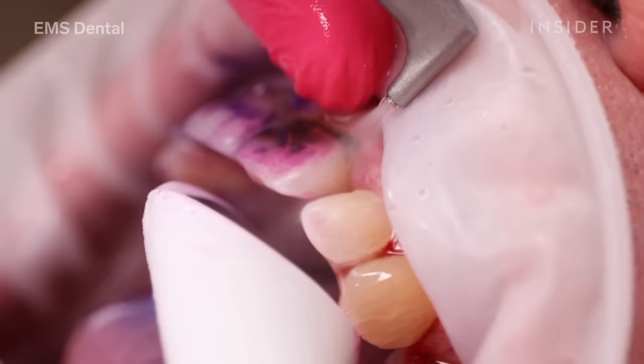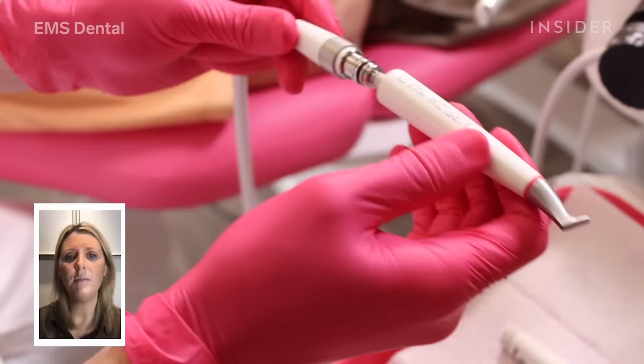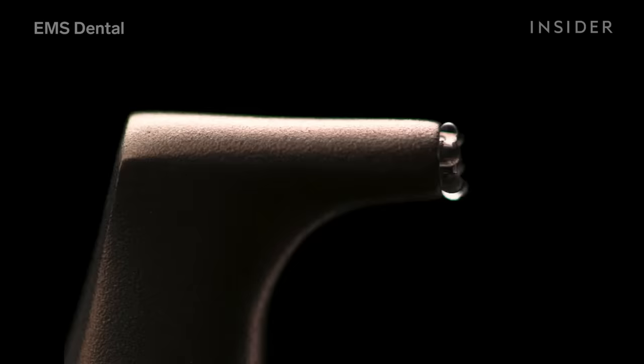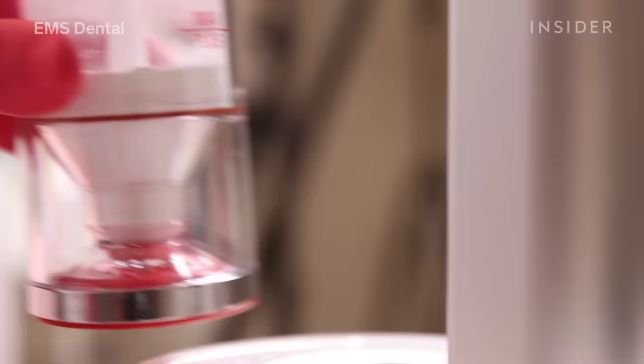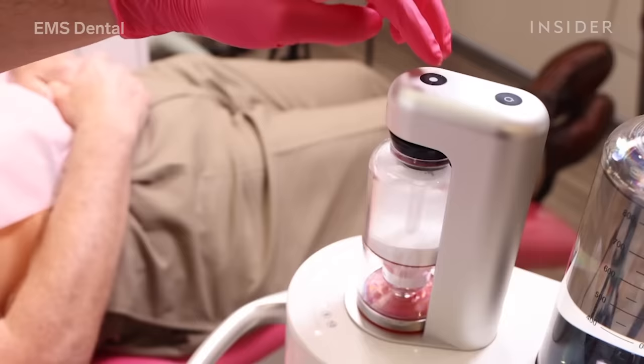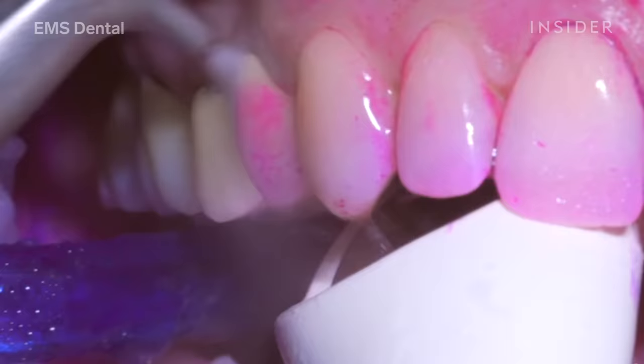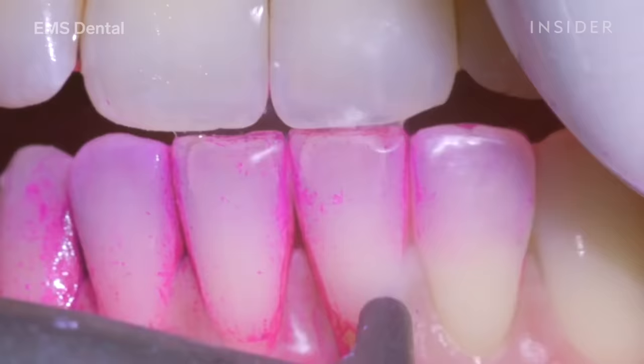This is where we start the cleaning process, and it is completely different to the old-fashioned methods of curettage and hand scaling. Here I'm using a tool called Airflow Max, which acts like a warm jet wash for inside the mouth, using a combination of warm water and tiny soluble and antimicrobial powder.